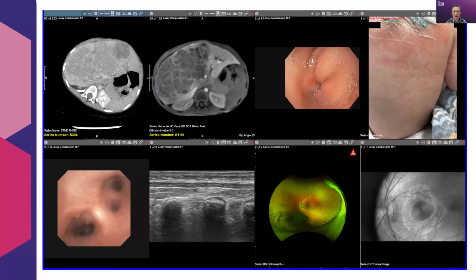And it's not just related to DICOM routers. This information can be used to build display protocols. We have imaging across the enterprise, not just radiologic imaging, but scope imaging, photography, point of care ultrasound, ophthalmology imaging. Sorry, that's a hard word to say.